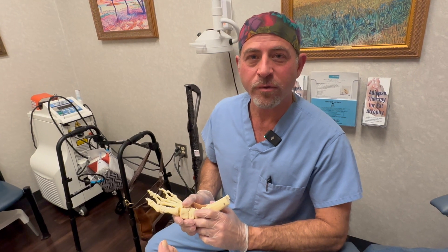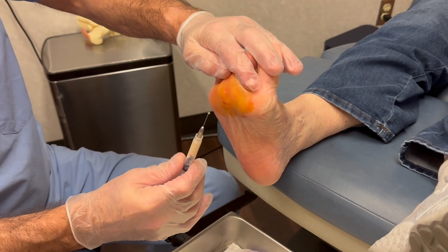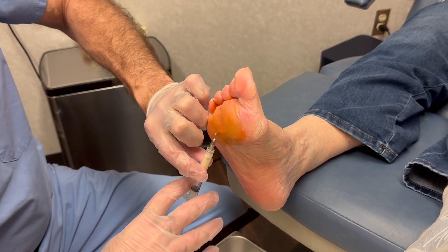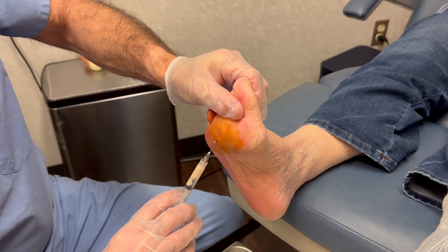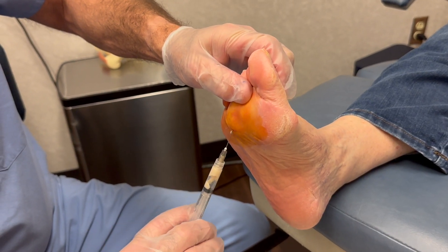Hopefully this will give her a whole new foot. Here is our adipose tissue and here's the area we were injecting. She has been numbed up so she shouldn't feel this. I'm in the area of the subcutaneous tissue, which normally is filled with lots of fat. As you can see, I'm injecting right here — and this is a safe area to inject.